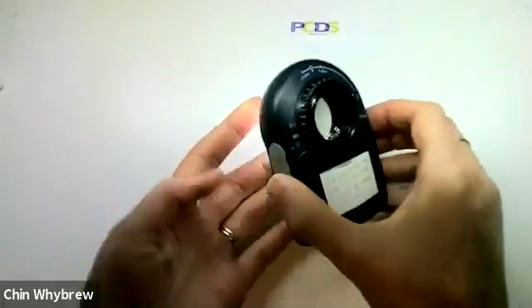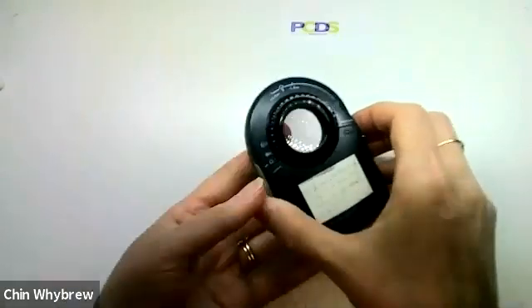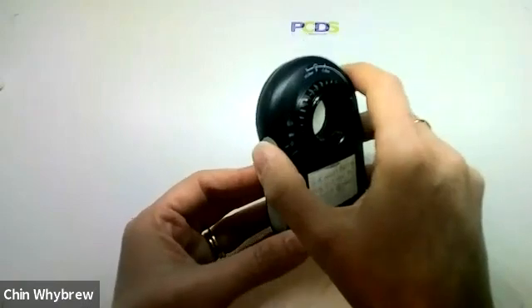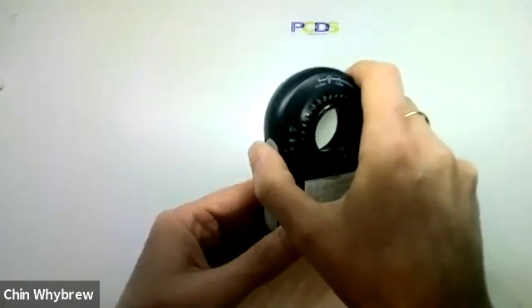The only way to tell is by looking through the scope to see if it looks like it's polarised light or not. There are ways to do that — we can tell you all about that at the Dermoscopy for Absolute Beginners courses.